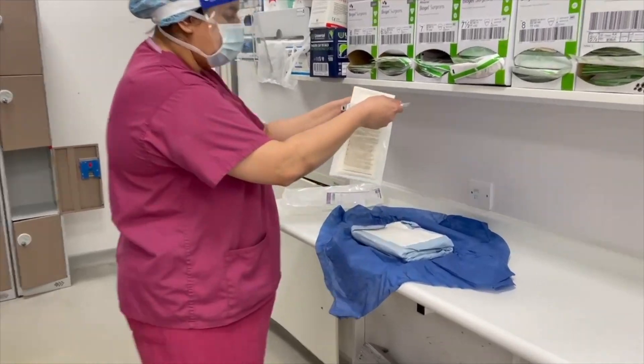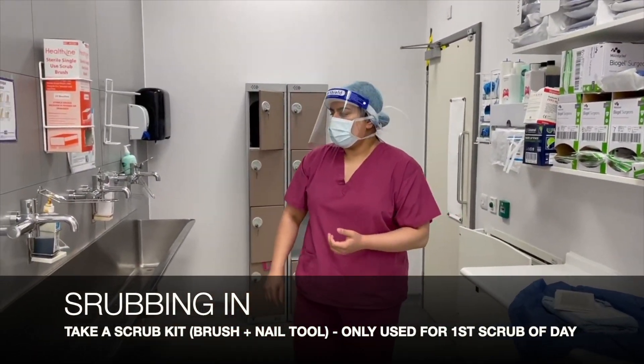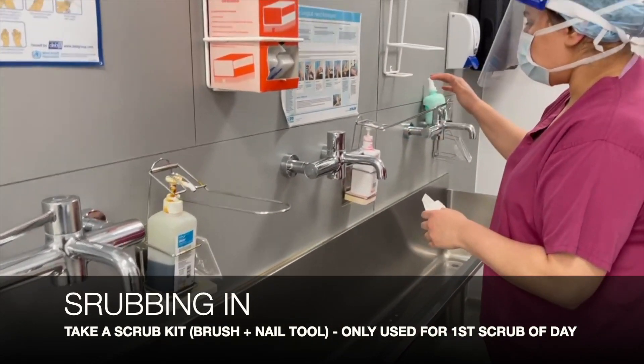From a height above the gown, we're going to drop the gloves in. Now we're ready to scrub in. We're going to take a scrub kit which includes a brush and a nail tool — this is only used for the first scrub of the day.